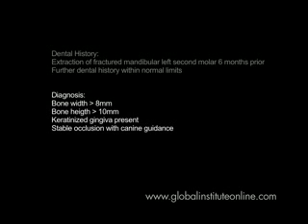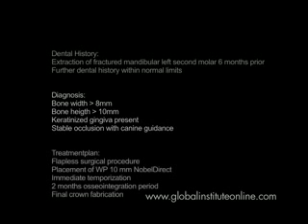The diagnosis on this patient is that in this particular second molar, sufficient bone width of more than 8 millimeters is available. More bone height than 10 millimeters is available. Presence of keratinized gingiva is sufficient, and there is a stable occlusion with canine guidance.